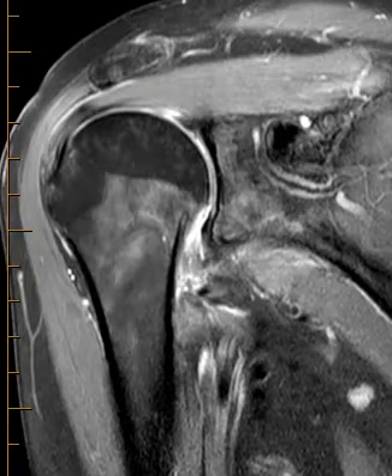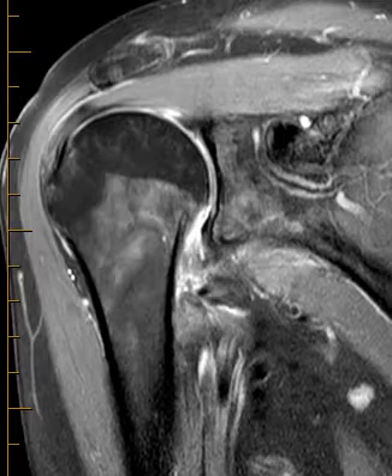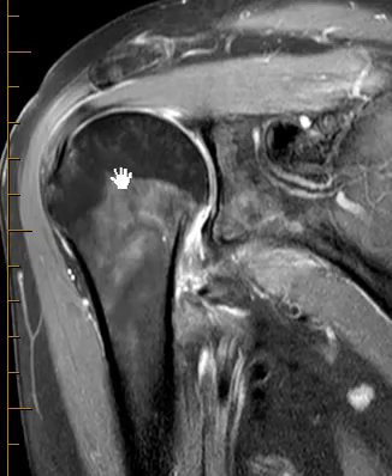Hello, this is Dr. Gay from FirstLake MRI. This is a patient who is 51 years old. They had a falling injury several weeks ago and continued right shoulder pain, and they come in with a right shoulder MRI.